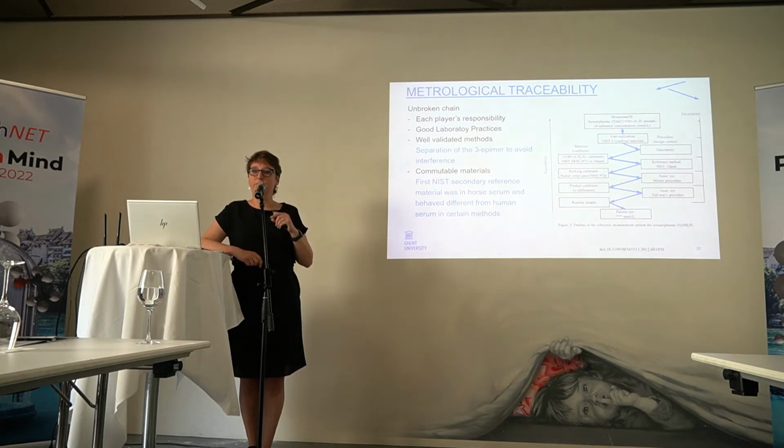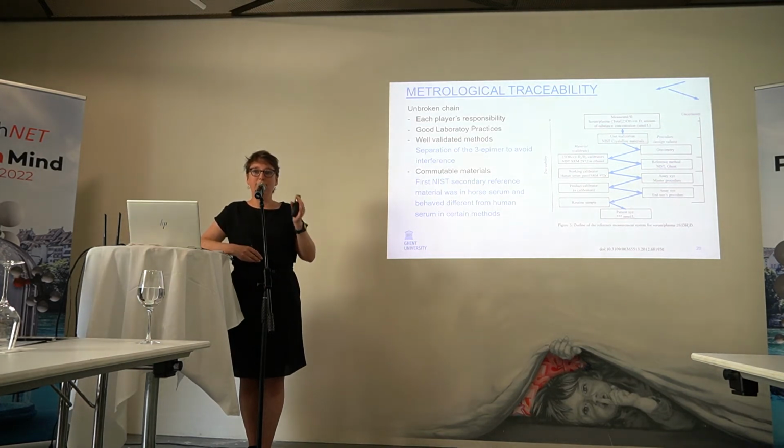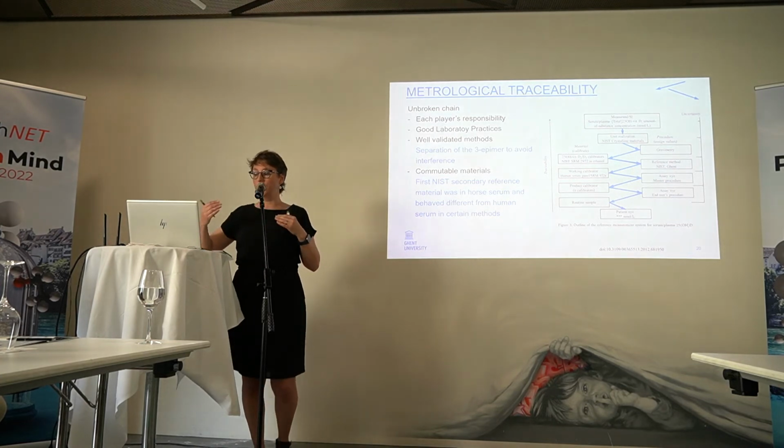Do you measure 25-hydroxyvitamin D, or do you measure also the 3-epi? And they had never heard of the 3-epi, and they actually measured the sum of the two, and the differences that they summed up for each material aligned perfectly with the amount of 3-epi D3 in that material. So no wonder that they couldn't meet the bias criteria, they were just measuring the wrong thing. So it's very important that you know what you measure.